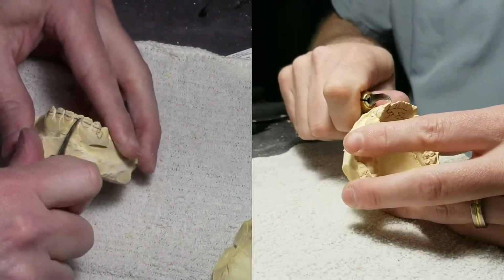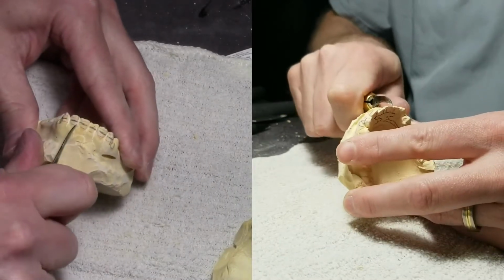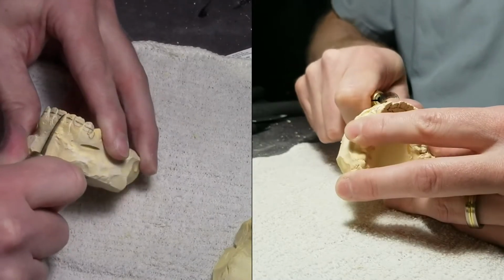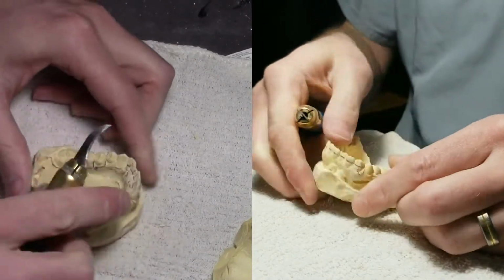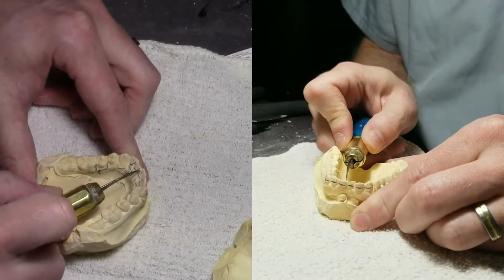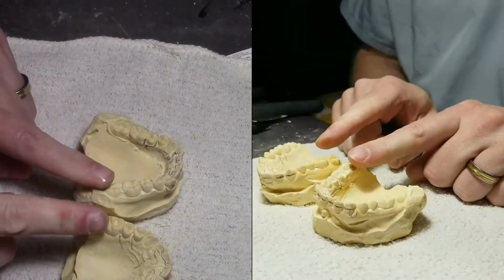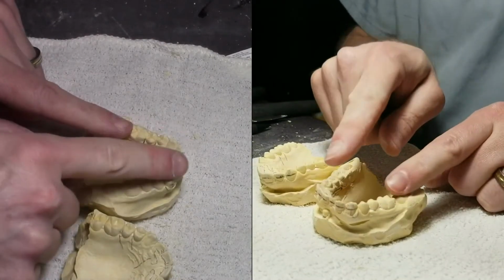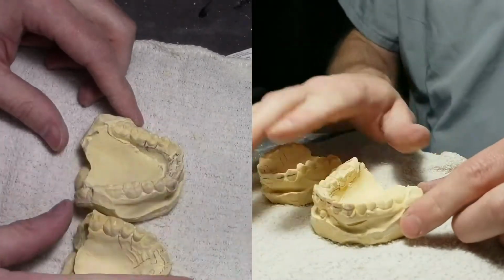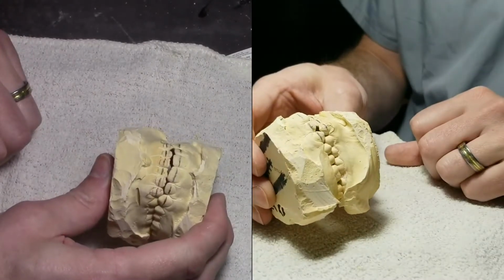So that's great about these spring retainers. If you want to see how to bend one and make one, I have a 3-part series. Some of my very first videos, and you can just search up spring retainer in YouTube and find them. And I actually do go over resetting these, but I don't know if I've showed one where I've reset upper and lower together in occlusion. First thing I'm going to do is reset the lower. And I usually reset the lower, set them to ideal, and then I'll reset the upper to match the lower. So it's a 2-part series. Again, here's the shot.